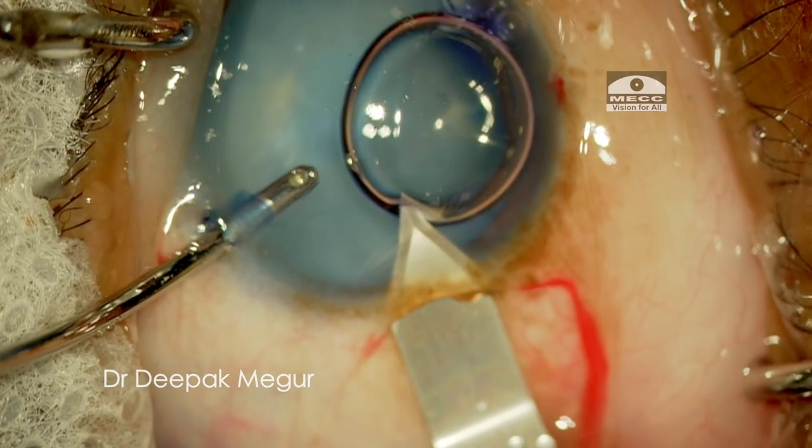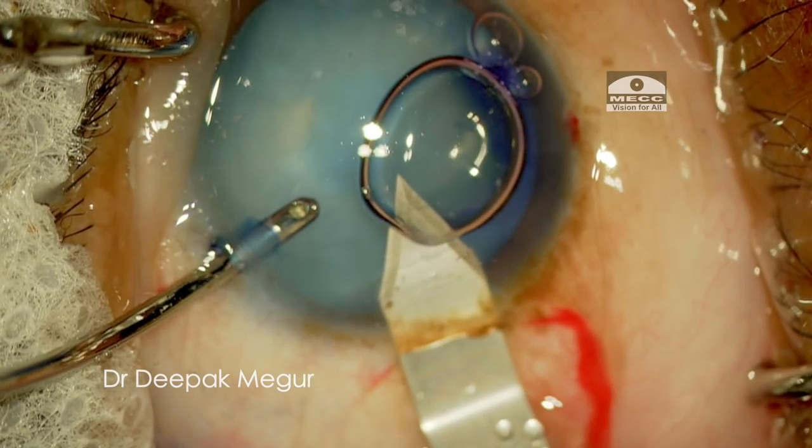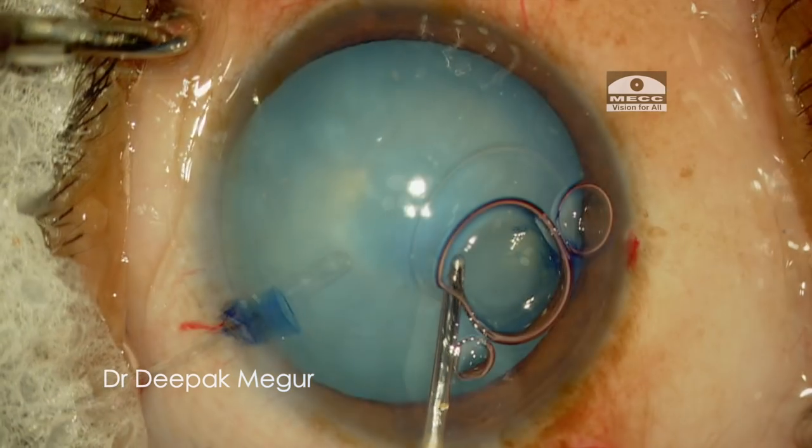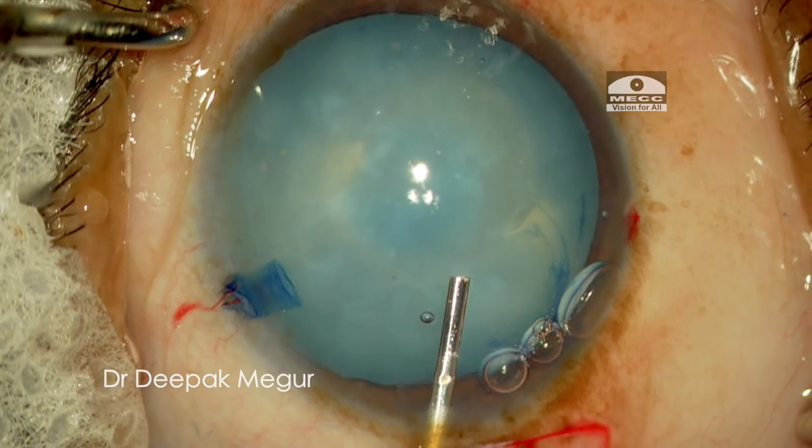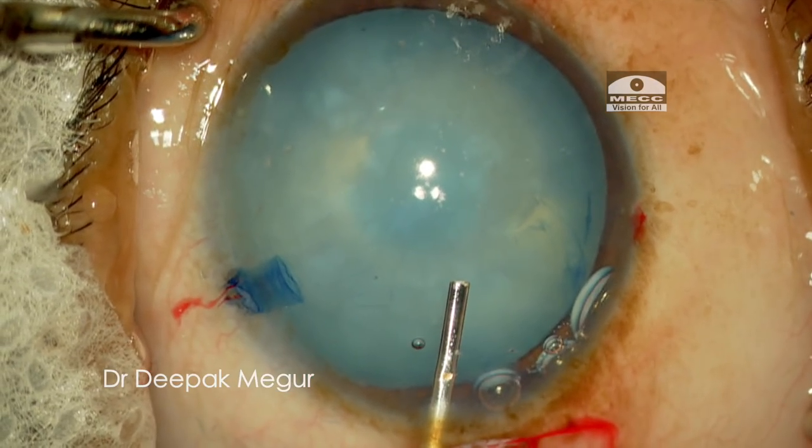Now I am creating my 2.8-millimeter posterior limbal main incision. Luckily, until now the anterior capsule is still holding well. Once the chamber is stable, I proceed with the capsulotomy.